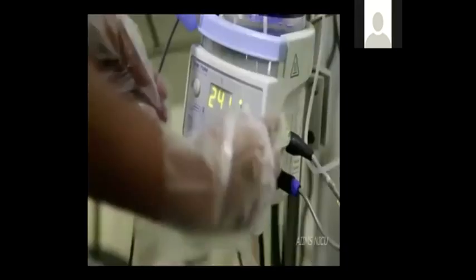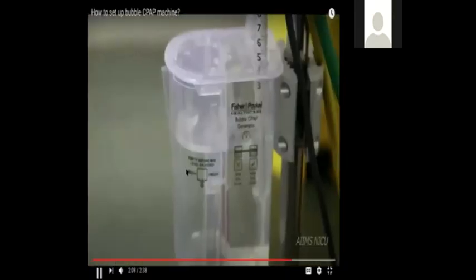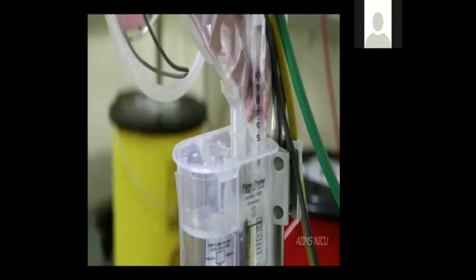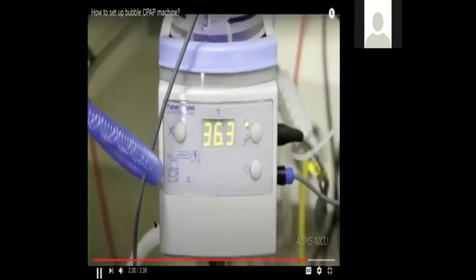Switch on the humidifier and set in invasive mode as shown here. Watch for bubbling in the bubble chamber. Set the FiO2 flow and pressure to appropriate level. Wait for the humidifier to display a temperature of 37 before connecting the circuit to the patient.